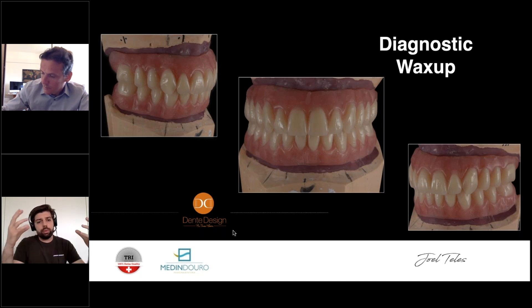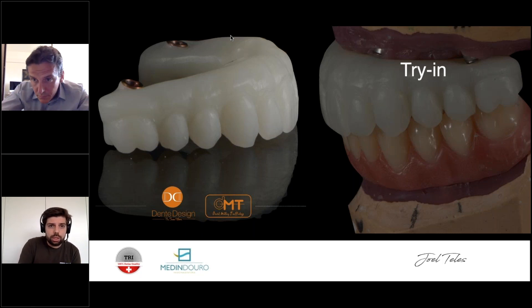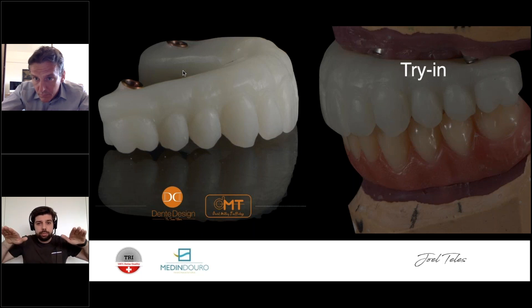The next appointment is the diagnostic wax-up from the lab. I do a quick try-in focused on pink and white balance and tooth shape — not heavy occlusion work. Occlusion is verified in the next appointment which is the try-in itself. This is a structure I can cut, add to, subtract from, and modify as needed. It's the first real feeling of the final result. Sometimes I ask the lab to draw red lines to better understand the correlation between pink aesthetic and white aesthetic. You can see the shape of the prosthesis here with the shelf design I discussed — easier to clean.